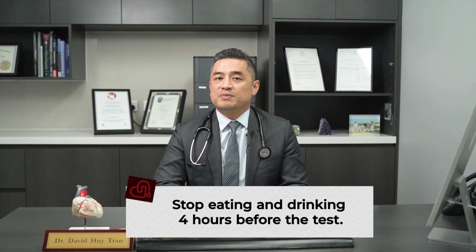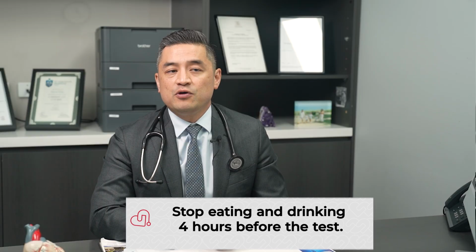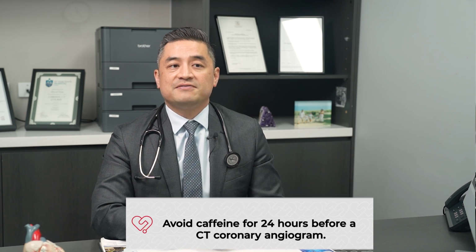Preparation is the key to getting the best possible images of your heart. So let's talk about how to prepare for your cardiac CT. Your doctor will give you specific instructions on when to stop eating and drinking before the test, usually around 4 hours prior. If you're having a CT coronary angiogram, you'll need to avoid caffeine for 24 hours before the test, as it can affect your heart rate.